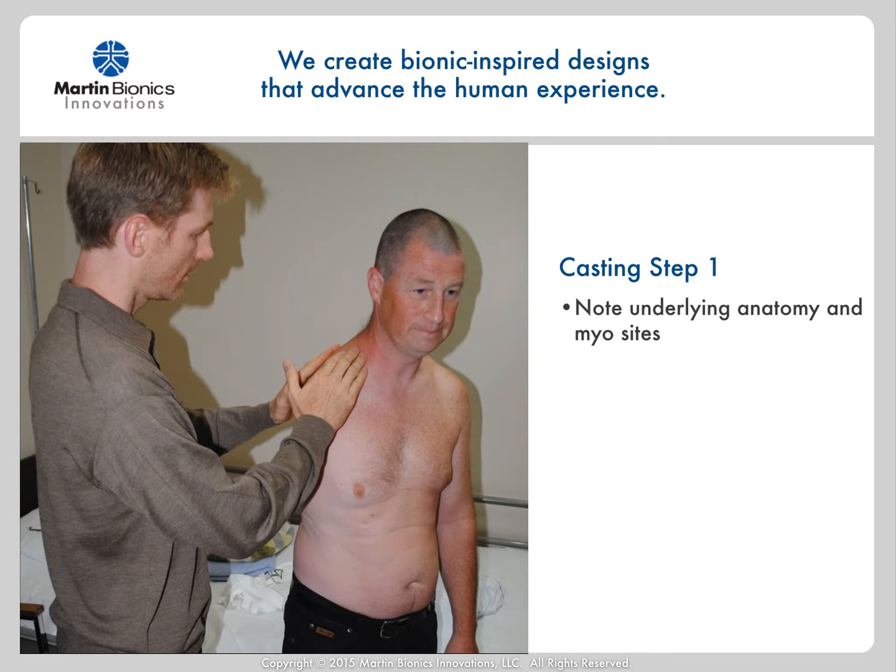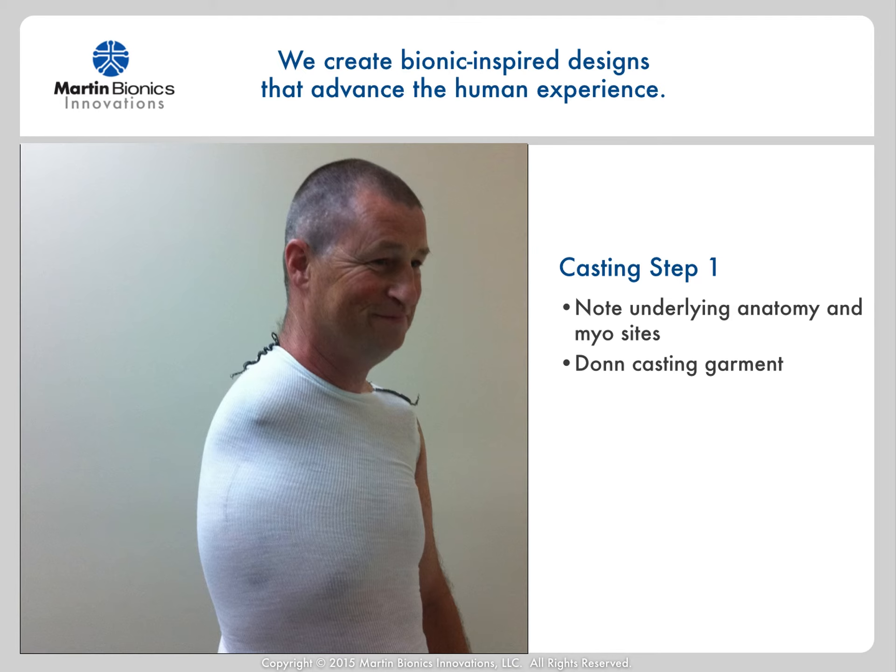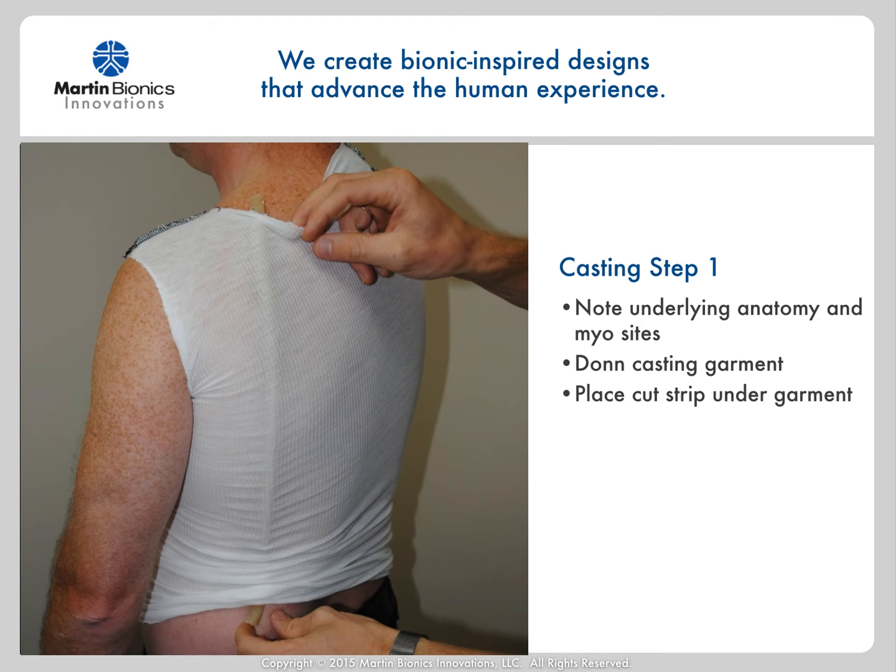I'll start by getting a good understanding of the patient's underlying anatomy. Next, don a snug fitting casting garment onto the patient. This will be helpful in both keeping the plaster off the patient's skin and hair, as well as give a surface to draw my landmarks and stabilizing unit trim lines. Next, place a cut strip under the casting garment, typically under the sound side, as this will be outside of our trim lines.